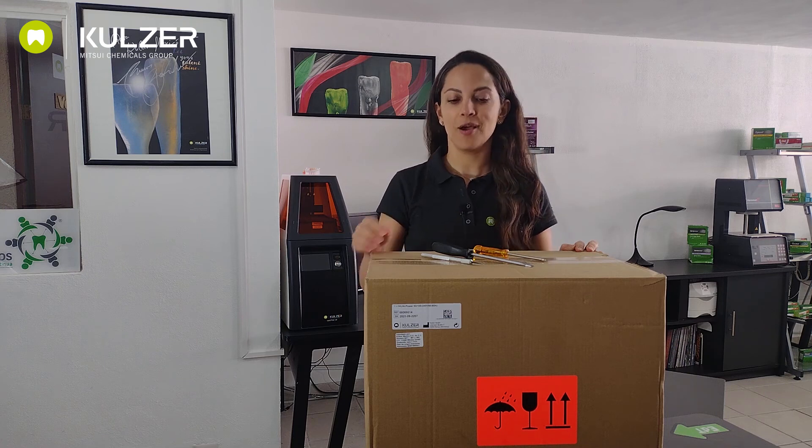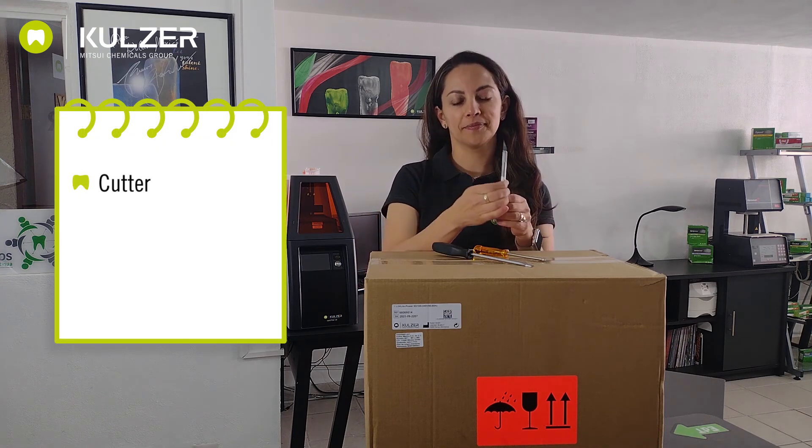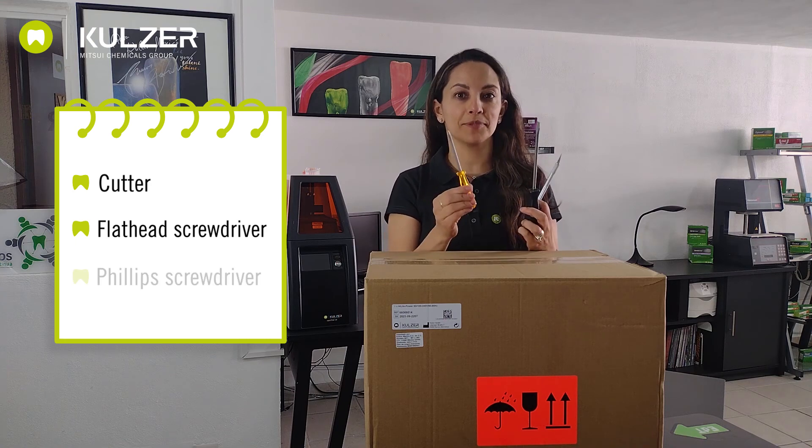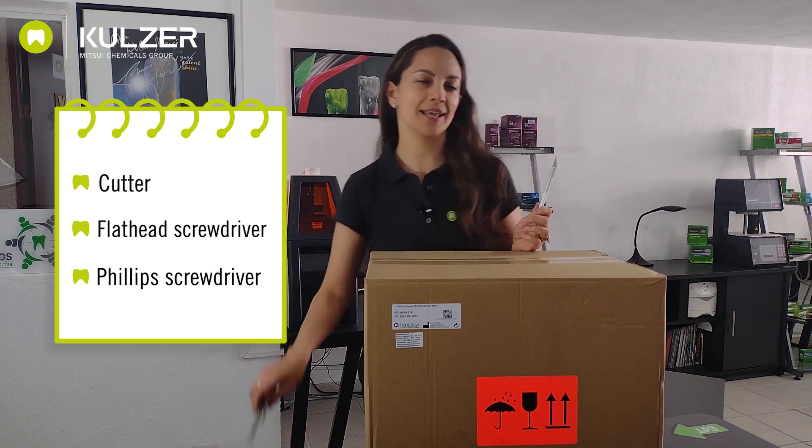Hi, how are you? I'm Helen and we're going to do the unboxing of a Kulsar Highlight Power 3D light curing unit. For that, we're going to need a cutter, a flathead screwdriver and a Phillips screwdriver. Let's get to work.